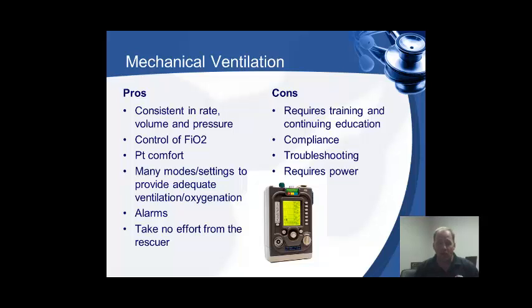It may just say ventilate the patient manually. At that point, you just put them back on the BVM until you figure out what's going on. It doesn't take any effort for us. Once we get it set up, we can do some other things to take care of our patient.